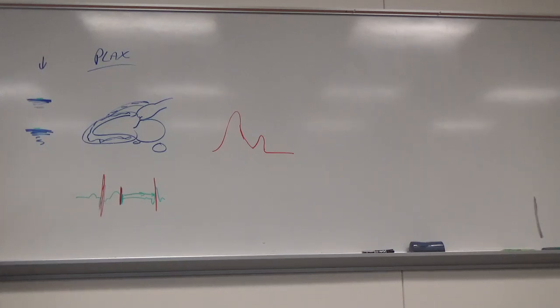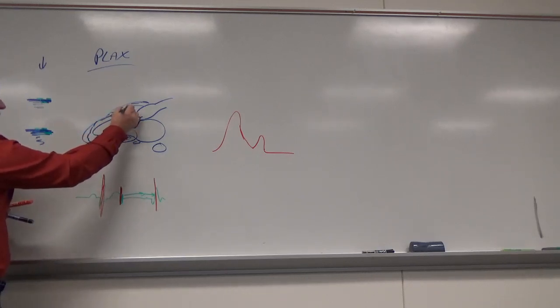Yep. So what we're going to measure, we're technically going to be doing leading edge to leading edge on almost everything. The other ones that we could be doing are inner to inner, which means the inside of it to the inside of it, or outer to outer, for example for aneurysms. We measure from the outer here to the best we can see of the outer there. Those are different modalities, but in echo we're going to do mostly leading edge to leading edge on our views.